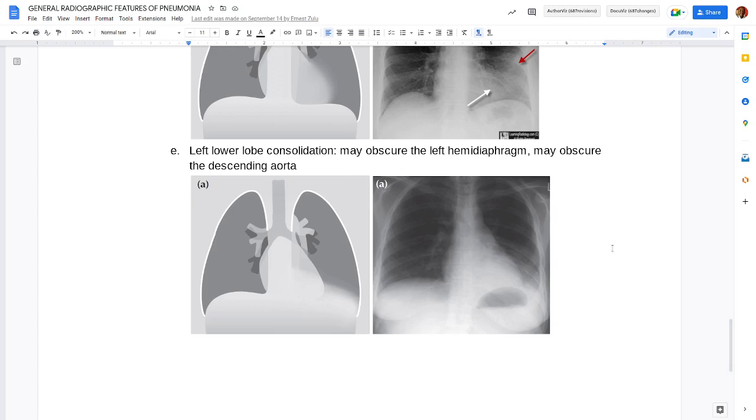The white patches will be very, very small, but they will be dotted all over the lung fields. So that is called nodulation. It will not come as a white patch. It will come in the form of very small nodules that are infiltrated all over the lung.